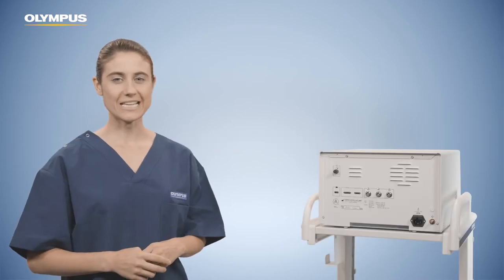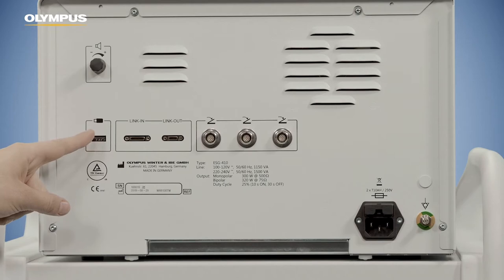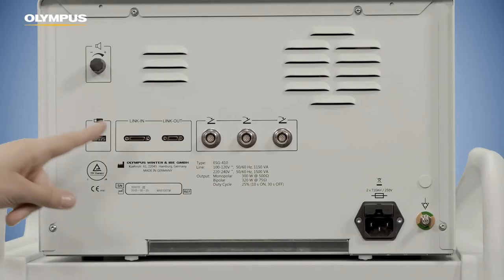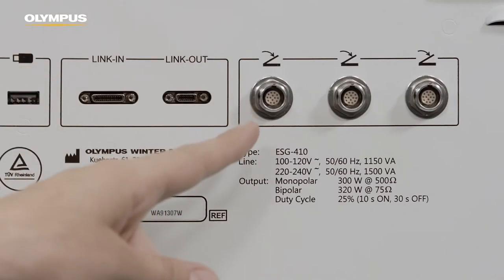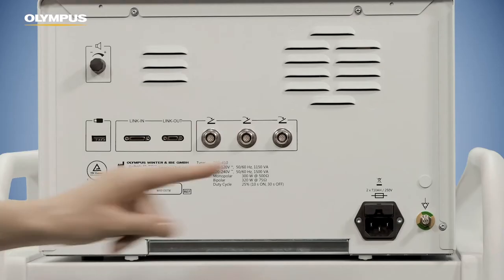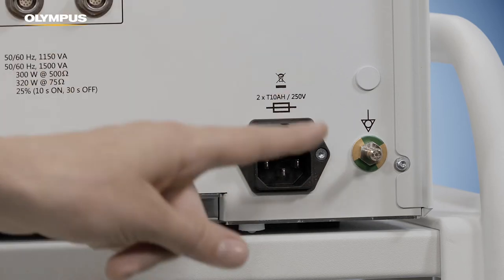On the back side of the ESG 410, you may find the volume control, which is used to adjust the volume of the activation tone; the USB socket to connect a USB flash drive to export procedure settings or to upgrade the software; the link-in and link-out connection for communication with peripheral equipment like the Olympus UHI insufflation unit; three sockets to connect wired footswitches or receivers of wireless footswitches; the power socket to connect the ESG 410 to the main electricity; and the potential equalization connector.